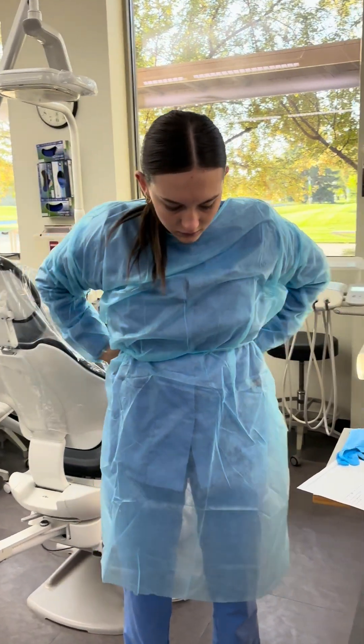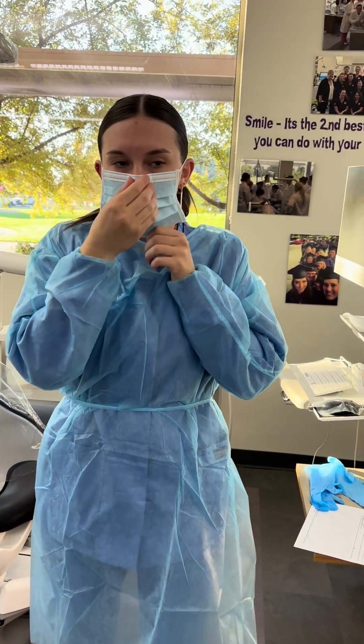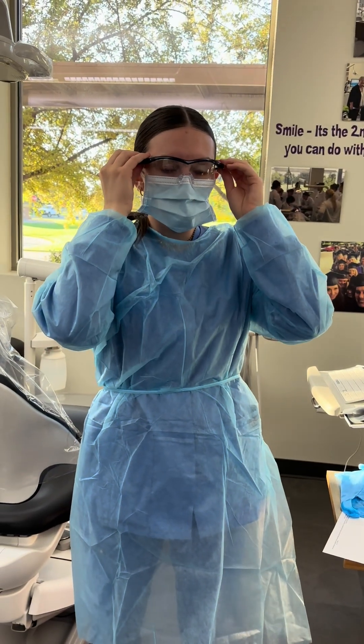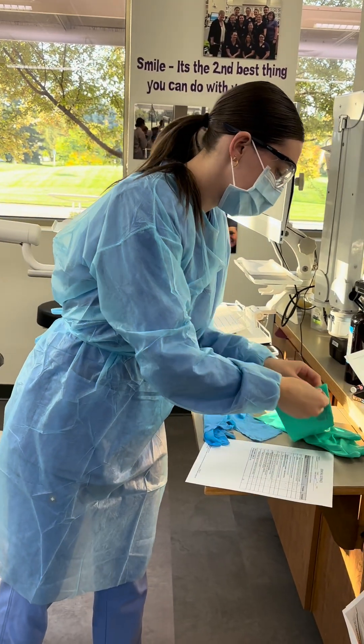And now she's going to put the mask on, making sure it's in the bridge of the nose. And glasses. And lastly, the gloves.